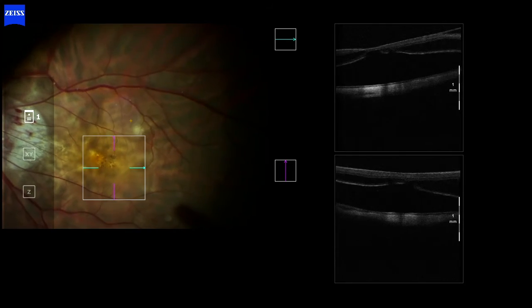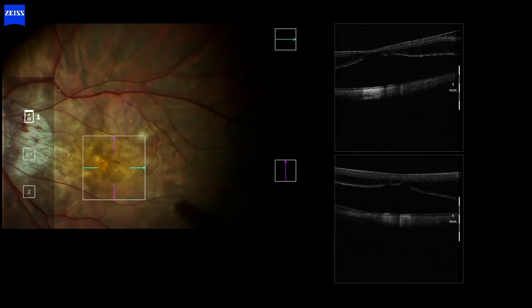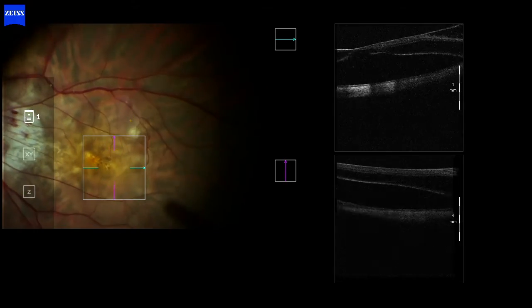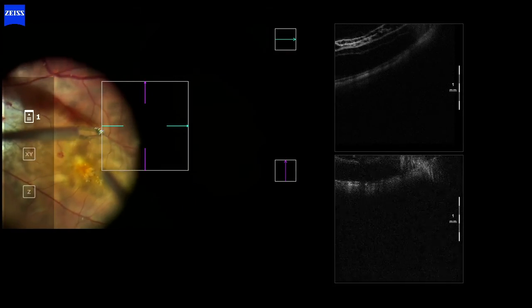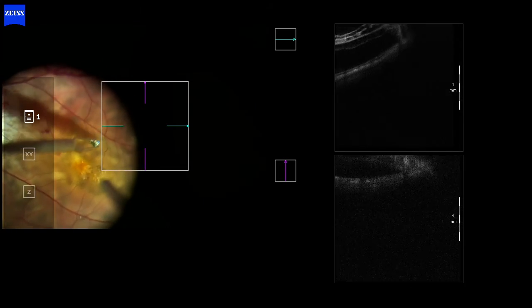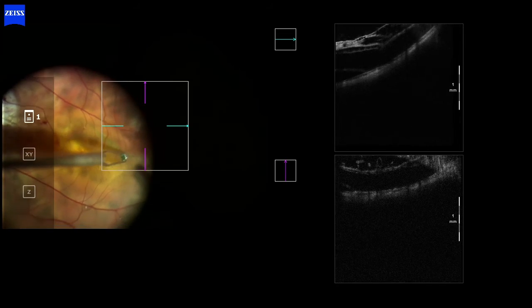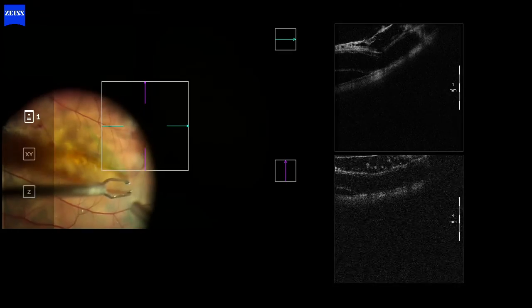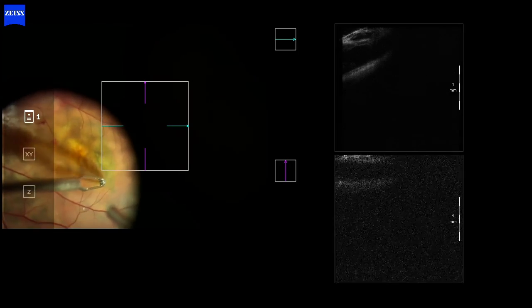During this case, we can see in the intraoperative OCT the small amount of foveal tissue and the defect in the inner segment and outer segment junction, which is a biomarker associated with secondary macular hole formation. OCT can provide more visual information to the surgeon to guide ILM peeling without stressing the foveal area and also confirm or not the presence of a macular hole during the surgery.